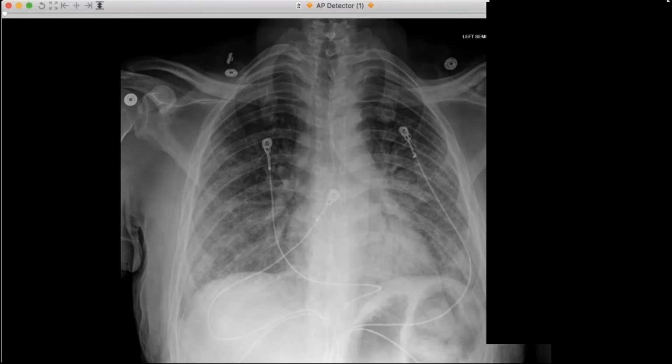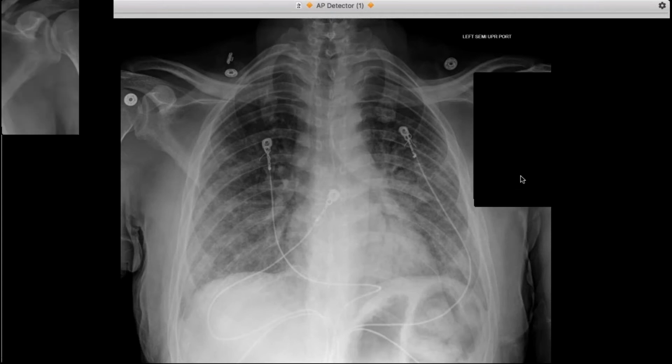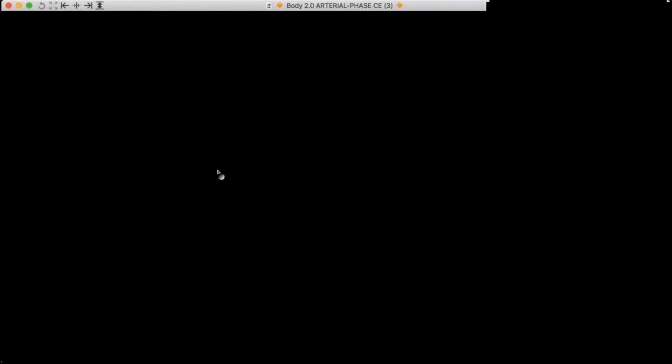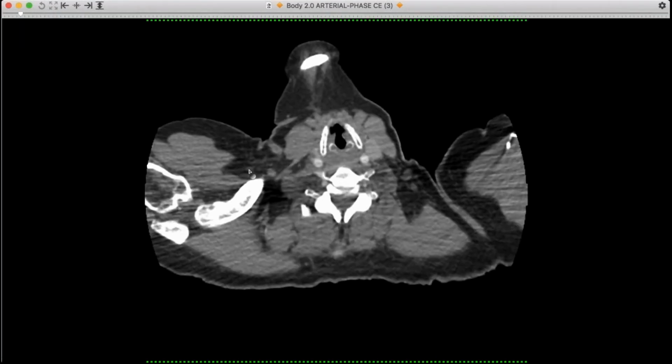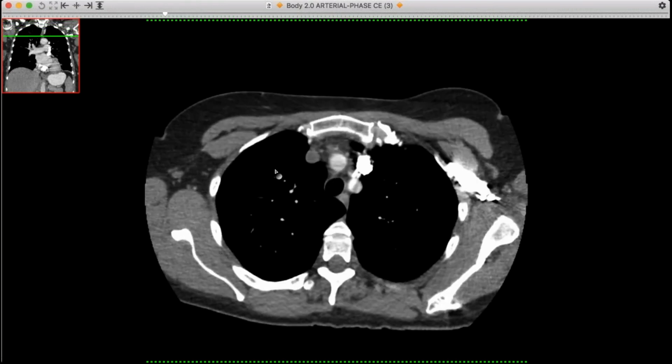Okay. Yeah, very nice. And then this is a companion case, and let me pull it up and then share the images. This patient was presenting with some neurologic symptoms, and they did an echocardiogram and saw some abnormalities and proceeded to do a bubble test. When they injected the left upper extremity, the bubble test was normal, but when they injected the right upper extremity, the patient had a TIA promptly thereafter, and it subsided. So the CT was done to look at this anatomy.